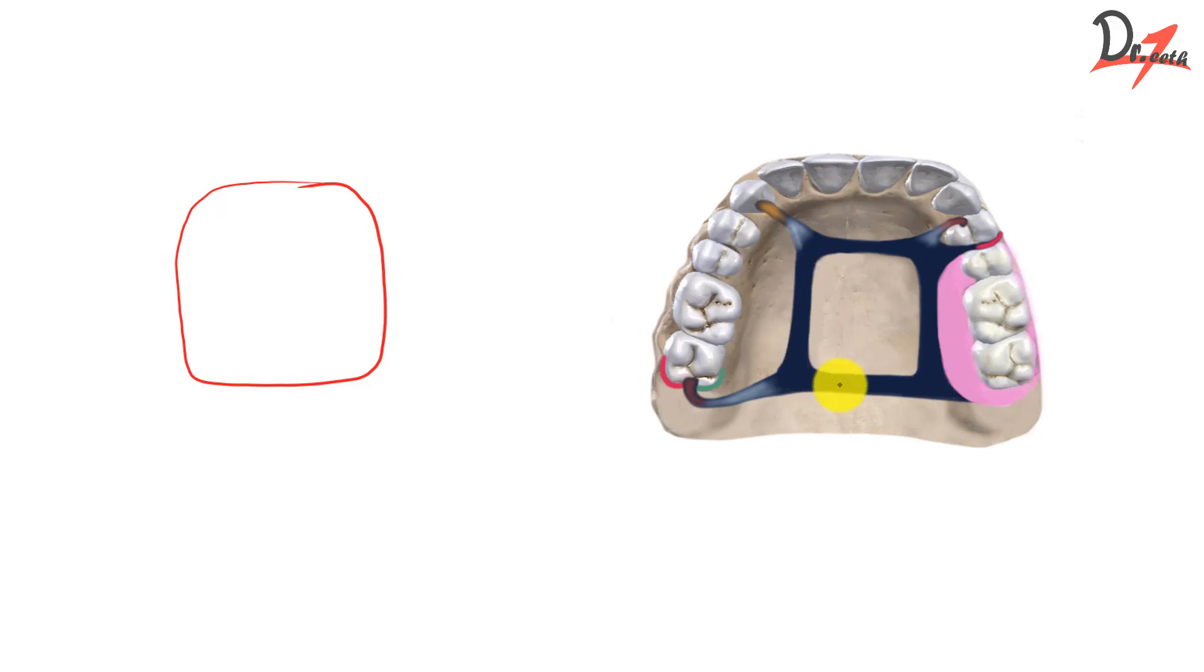So this is a connector and to be precise, this right here is a major connector because it is connecting one side of the arch to the other side of the arch. Removable dentures must extend to both side of the arch. Why? For stability because forces of occlusion can then be distributed to all the supporting teeth and tissues. And this connection between one side of the arch to the other side is established by major connector.